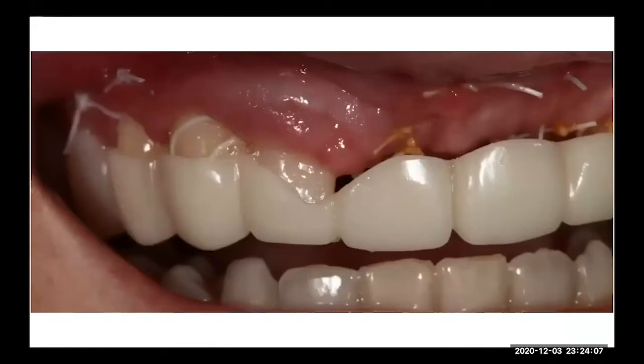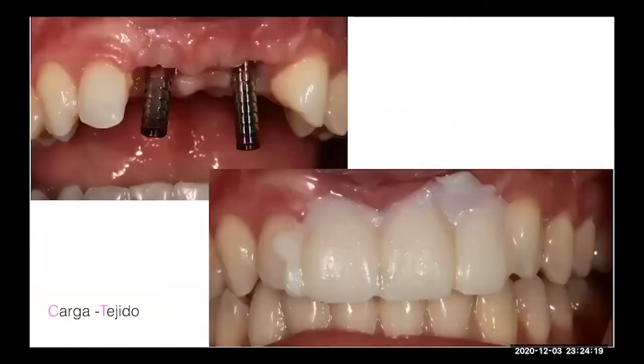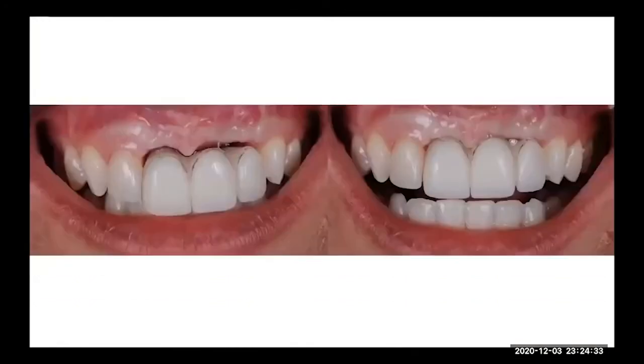the implants healed. The prosto guy put some snap-on restoration until the implants got healed properly. So when the patient was ready to take the impression, we did an indirect impression to get an exact copy of the temporaries to mimic all the restoration to that. So these cases are special. Like I said before, I normally work with 3 prosthodontists next to me. So the big cases and the important cases, normally I'm available to start the case in the morning and finish the case in the afternoon, no matter what.